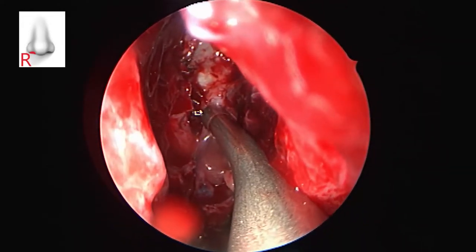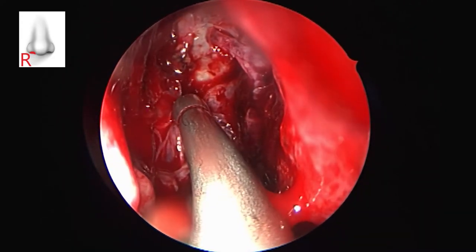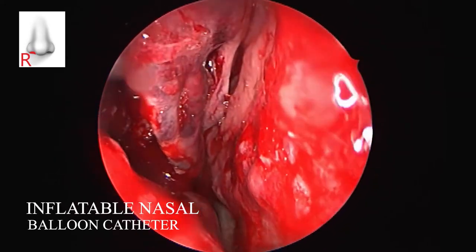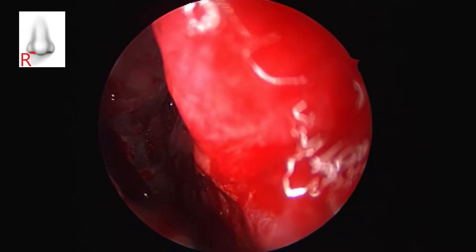A quick nasal endoscopy is performed, assessing the fracture of the lamina papyracea to ensure that no active bleeding remains. We end the intervention by inserting and inflating a nasal hemostatic balloon catheter.